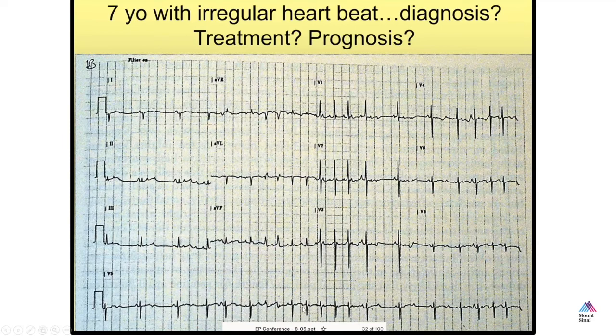This P wave is sort of biphasic here. So I would say that there's at least 3 different P waves on this tracing. It's not a great tracing, but it looks that way. So what would we call this if you have multiple different P waves? It's not fib, it's not EAT, because we've already explained that with EAT there would be a single P wave morphology. So what do you think this is?